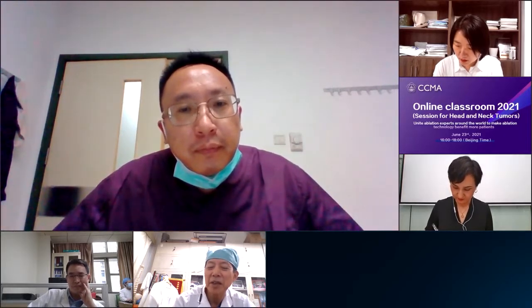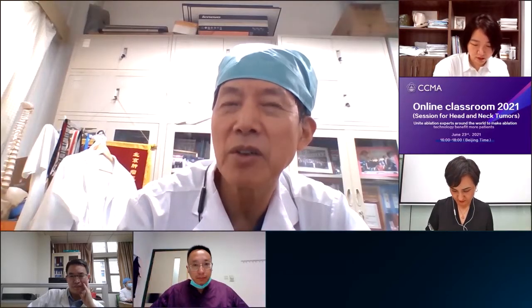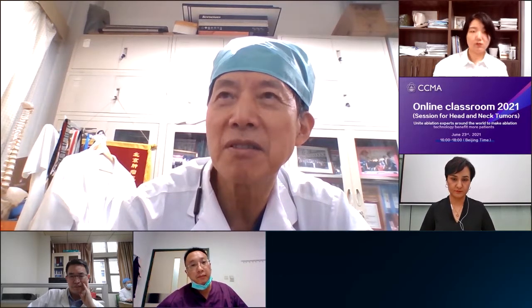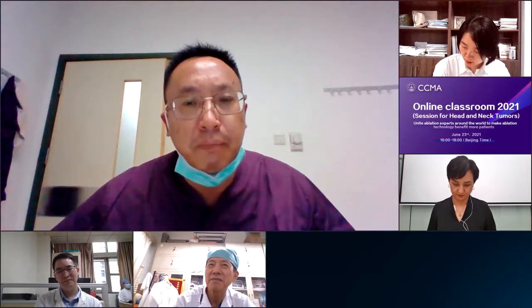You mean that for cystic thyroid nodules, 就是囊性甲状腺结节治疗的微波治疗的问题。那个最关键的呢，就是如何抽吸那个囊性结节里面的液体，安全的抽吸它的液体，避免出血。Yes.